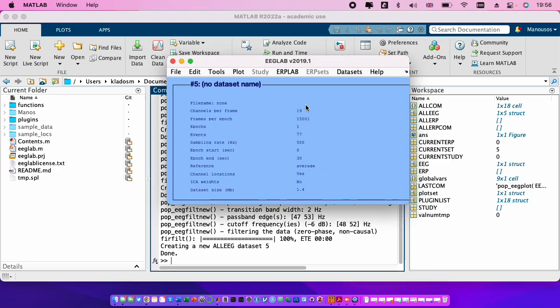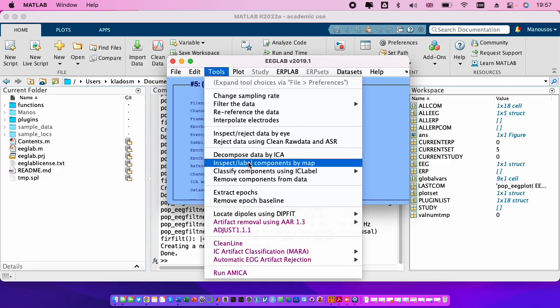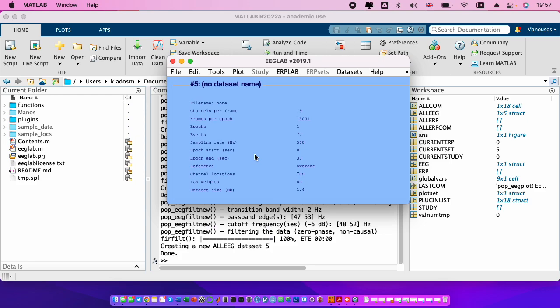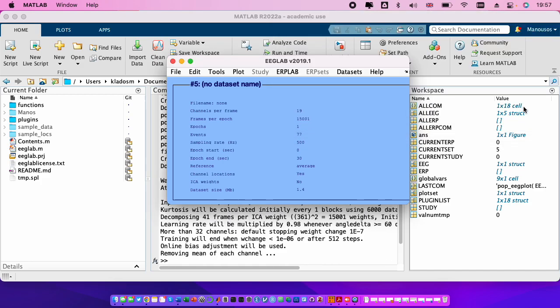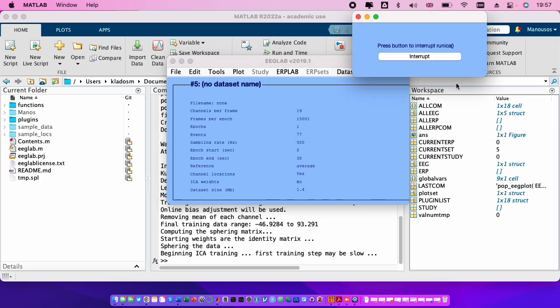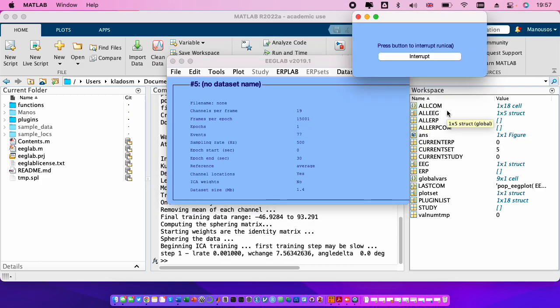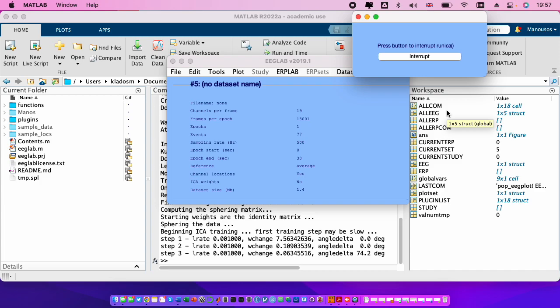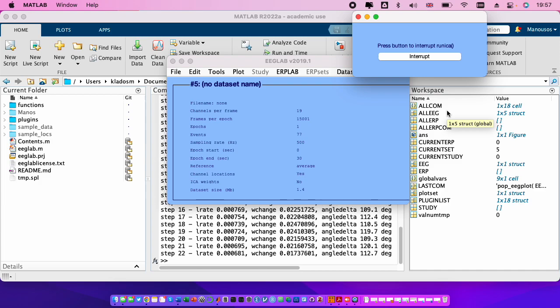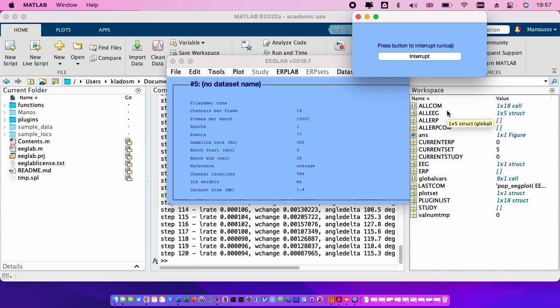So we go to EEGLAB, we do that with the ICA tools, decompose data by ICA. We choose run ICA with this command line options extended one. I will not go deeper on what is extended one and so on. We wait until ICA finishes.